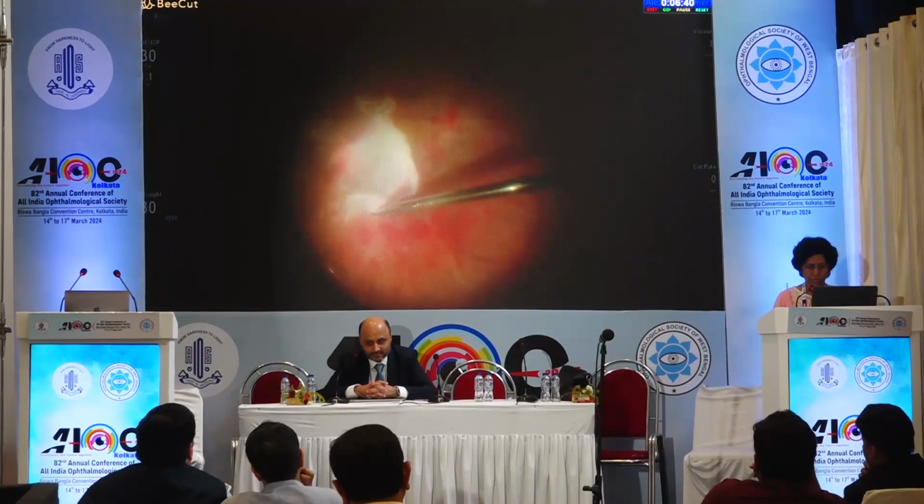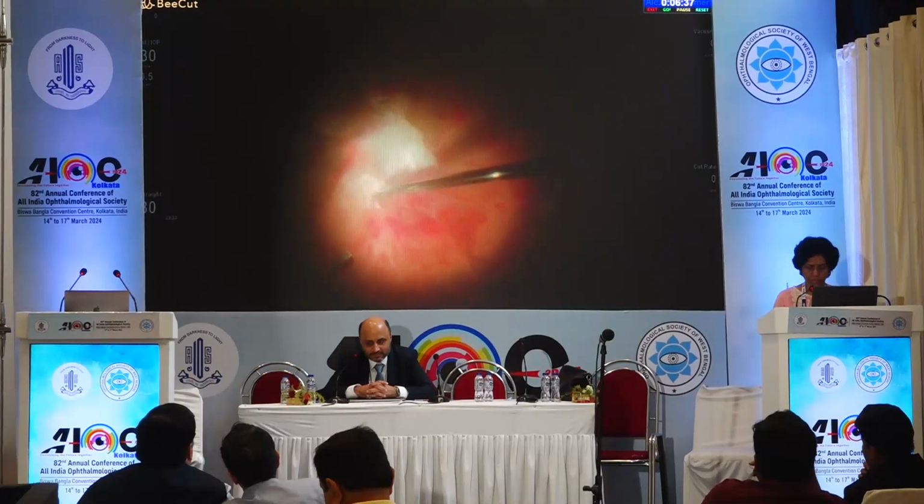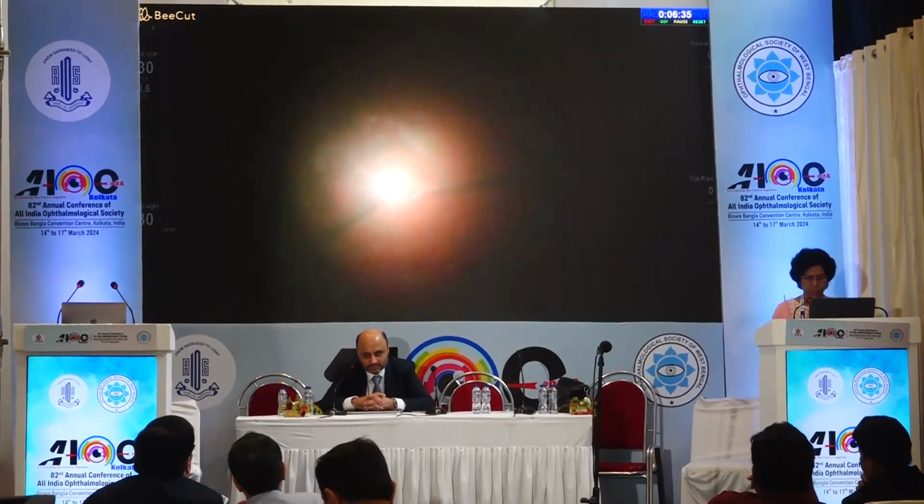So you can see here the retina is not that much disturbed, and it is easy to do the dissection. So maybe we'll go to the next case.